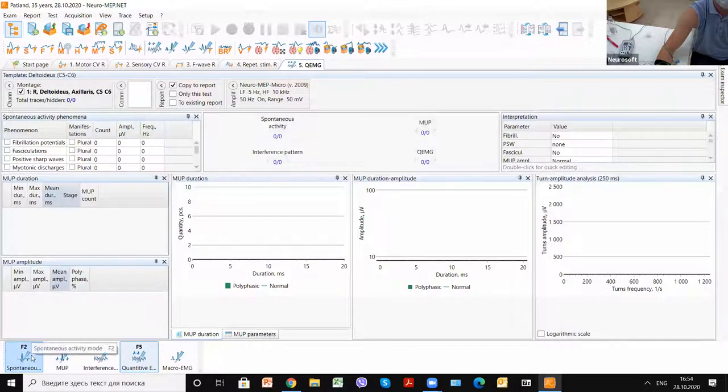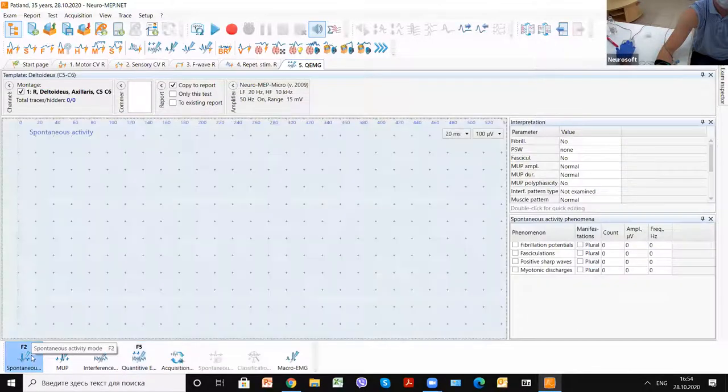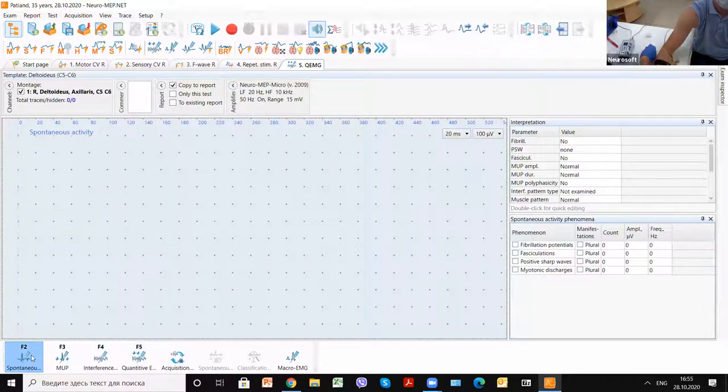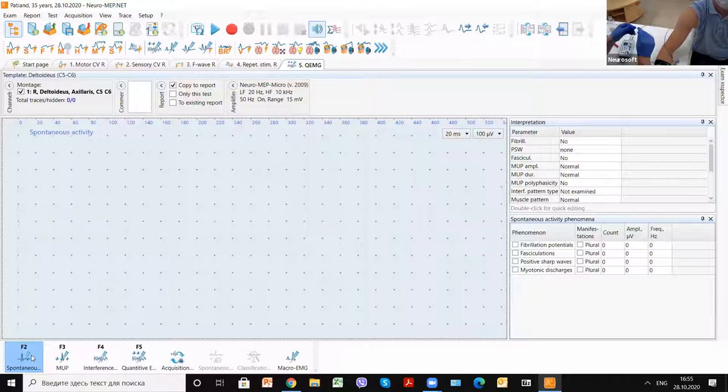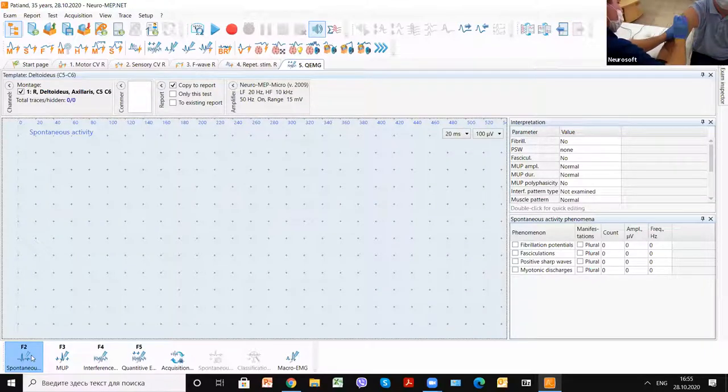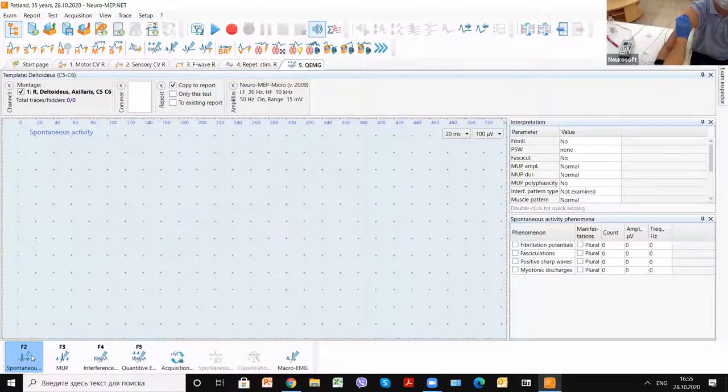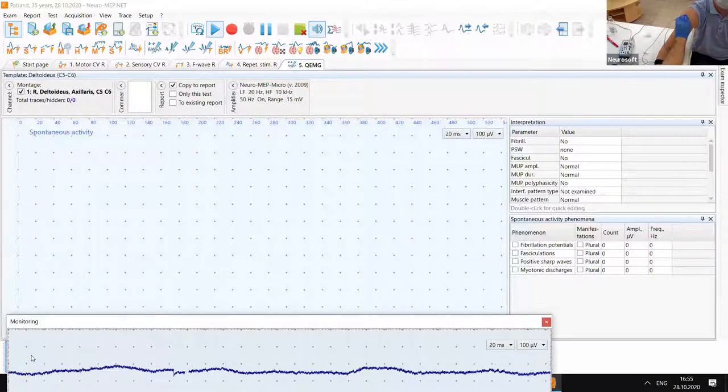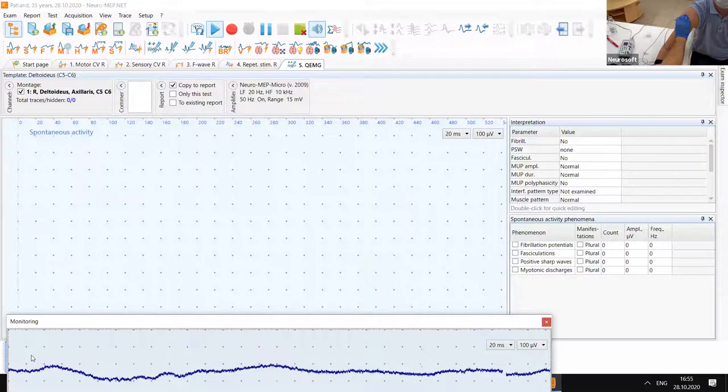First of all, it's better to start with spontaneous EMG. And now we can insert the needle. We start monitoring.